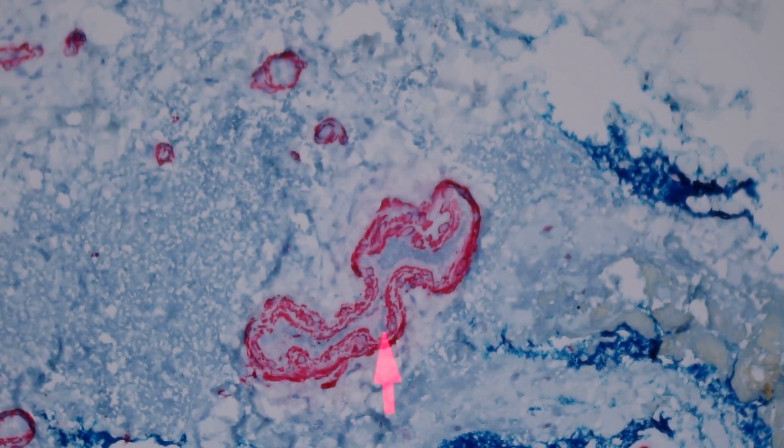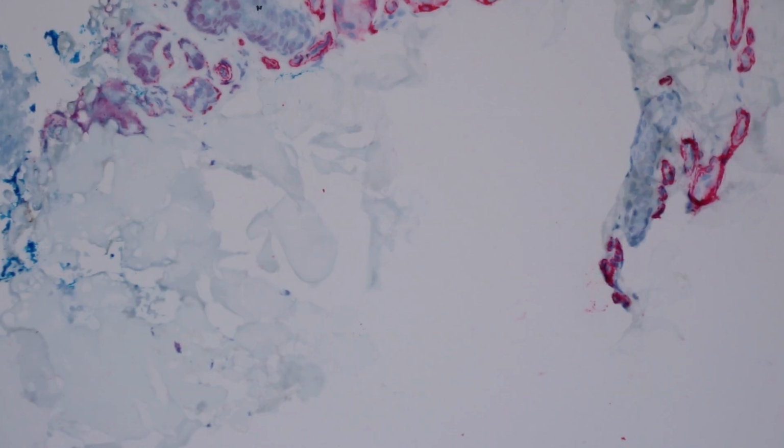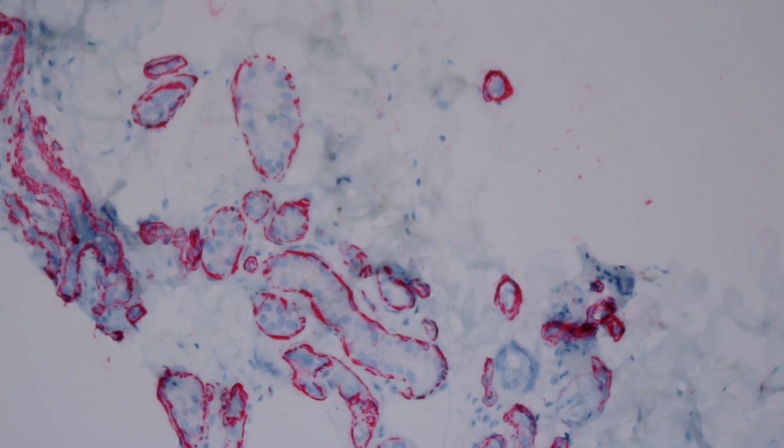Oh, here, this is better. You can see also, again, the muscle layer staining. The inner endothelial layer is actually negative on actin. So actin's a nice stain for vascular smooth muscle. And the one other thing in the skin that actin will stain, we can see it right here. This is the eccrine coils again. The eccrine coil, the outer basal layer, has myoepithelial differentiation, which means it has some component of muscle type proteins in it. So in this case, actin is present here.